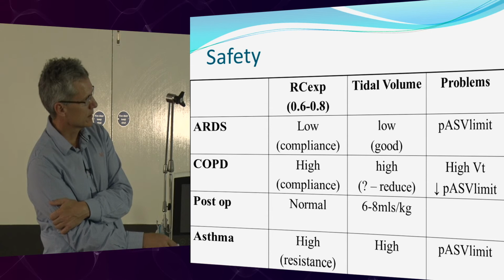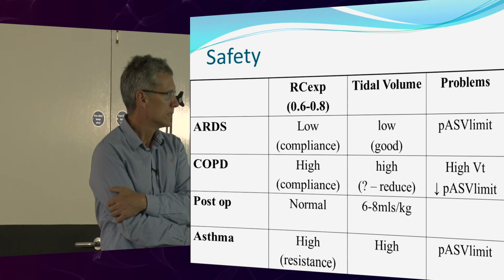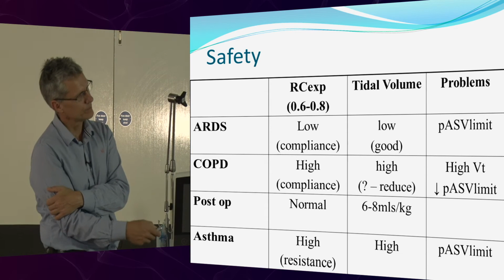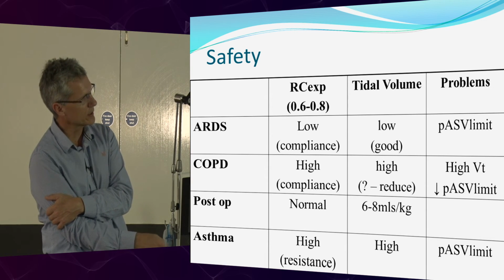COPD, the time constant's high. This will give you a high tidal volume. I know a lot of people are uncomfortable with this. How you prove this in research would be quite tricky. But thankfully, for us, it's not a massive patient group at the moment. If people are uncomfortable, what some people have been doing is reducing the PASV limit.